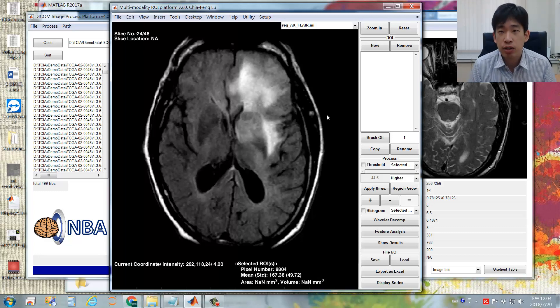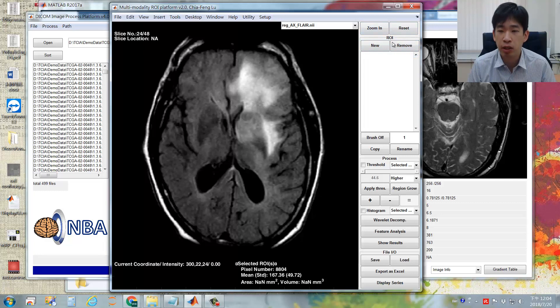Now let's introduce the three panels on the right-hand side. The first one is the ROI panel. The second one is the process panel. And the final one is for file input and output.